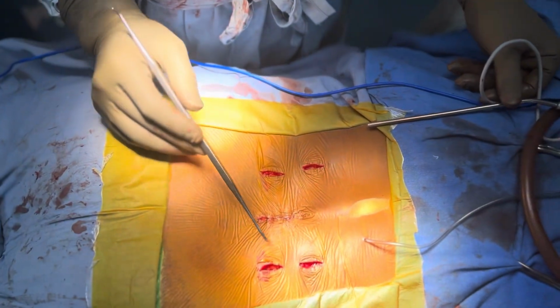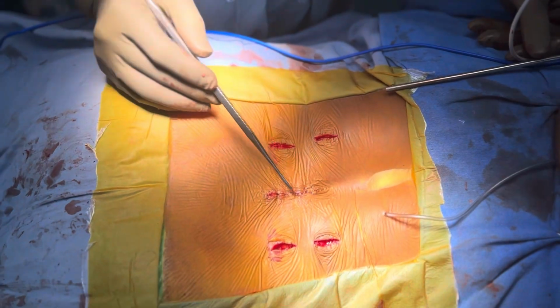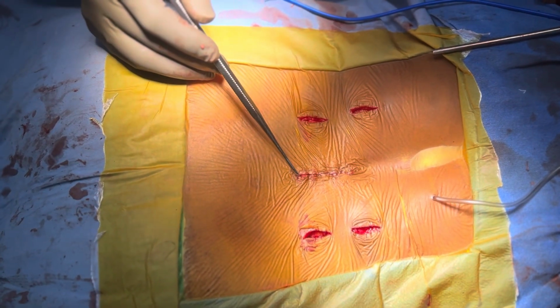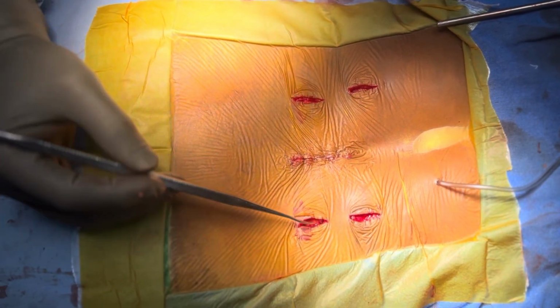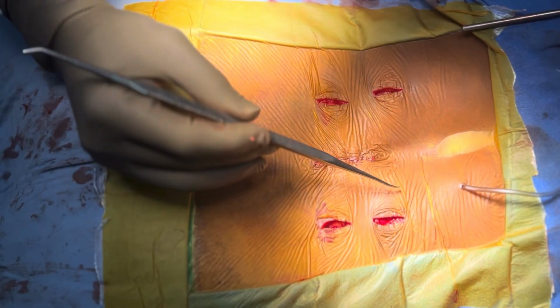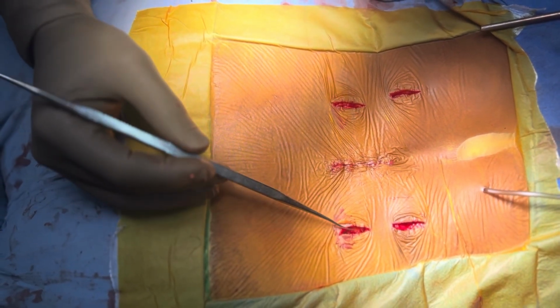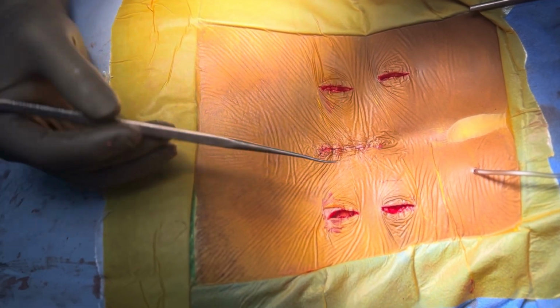Now this is just before closure. These are the 4 incisions of the 4 pedicle screws. This is a midline incision. One can call it a hybrid TLIF as we have done interbody work and decompression through this midline incision. If one wants to do tubular TLIF, then these incisions can be a little medial, and on C-arm they can be on the lateral border of the pedicles. So one can change these incisions accordingly, the way one wants to do the interbody work.